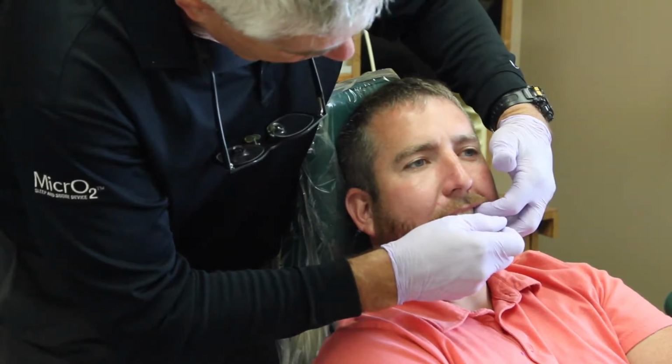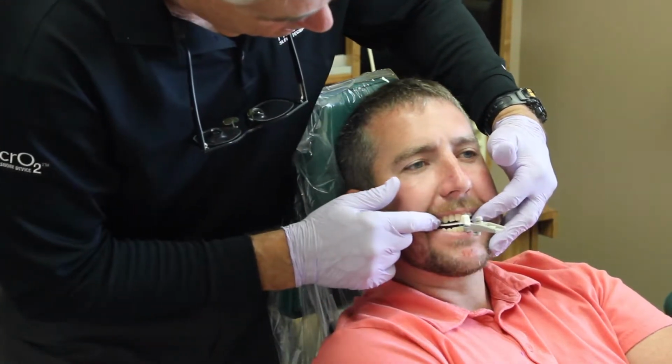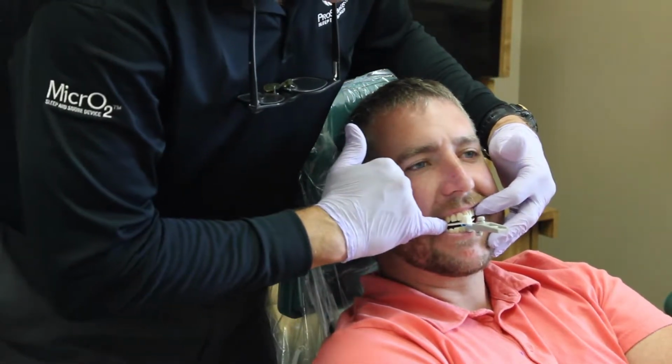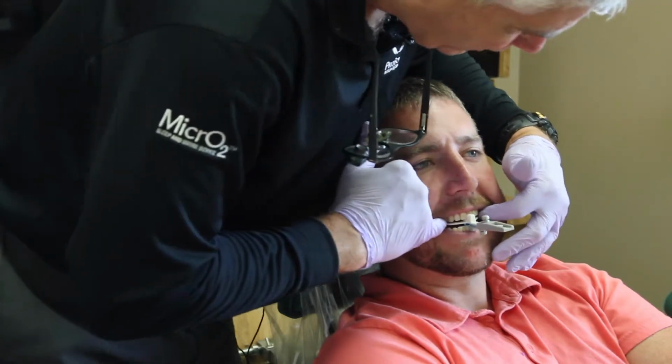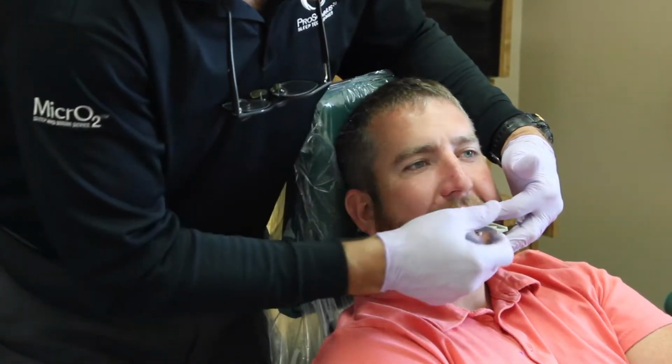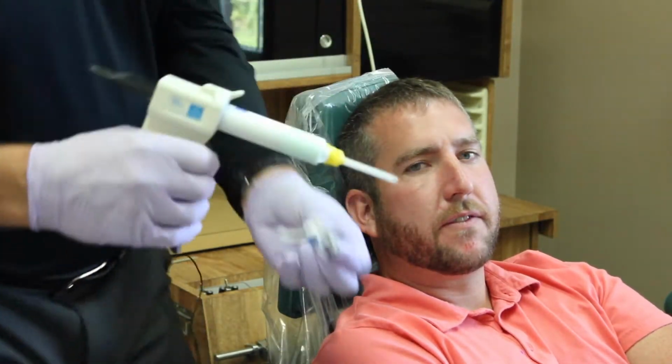Close together. Oop, slide forward. There you go, right about there. Can you feel that there, Jeff? Mm-hmm. Okay, so now I take a look at where the tray is, where the bite fork is, and where I'll need to put some impression material. And I'll need to have it sticking out just a little bit there. So I'm going to borrow this back from him, and I'm going to put some material on here.